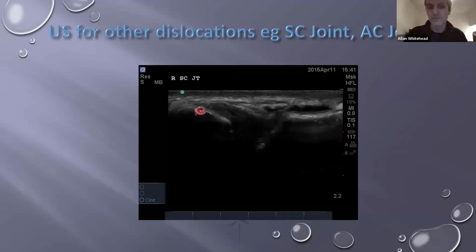which is nothing. So I actually disproved that this teenager had a sterno-clavicular joint dislocation by using ultrasound. Didn't have to put him through the CT scanner. In fact, if I recall correctly, he had a greenstick fracture of his proximal clavicle, which we also saw with the ultrasound and was not detectable with the X-ray.